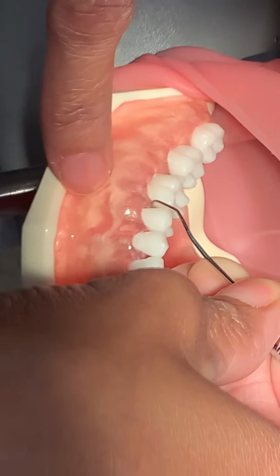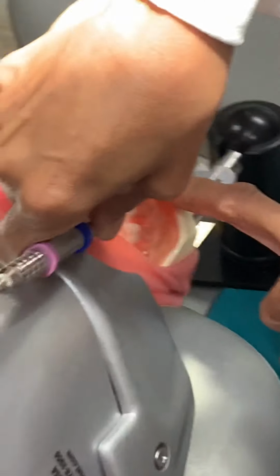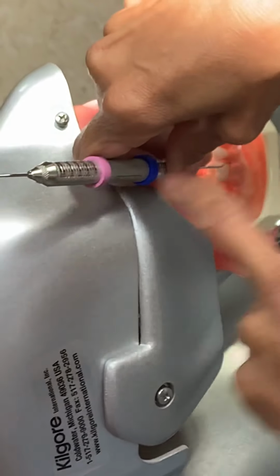I'm going to try the incorrect working end and show you the difference here. Of course, this is my terminal shank, and this is my functional shank. I can make it parallel, but if I do, the handle is going down the patient's throat. So that will let me know that is not the correct working end. And then you see also my position. Look at my arm and all that. It's just all out of whack.